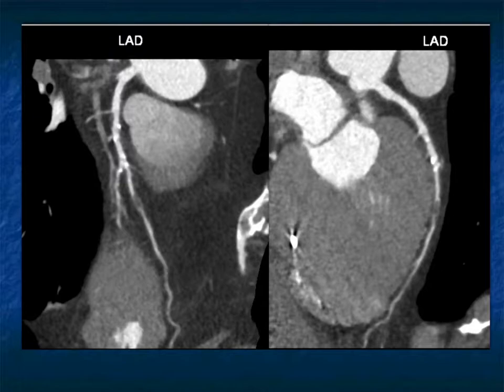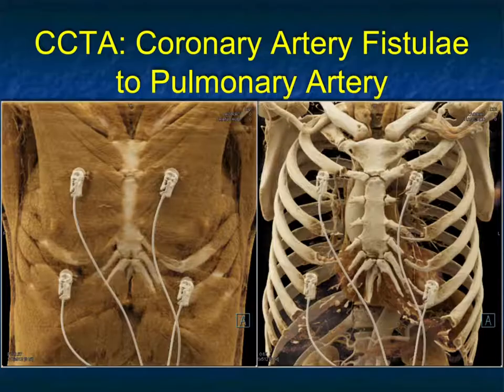So again, using all the information will be very valuable. Now, will that cinematic help the cardiac surgeon if they're going to do bypass or they're going to do a stent? That remains to be seen, but there does seem to be lots of optimism in that regard.